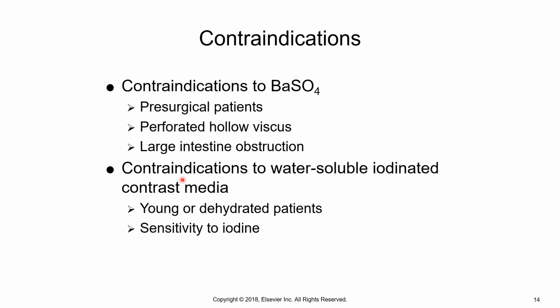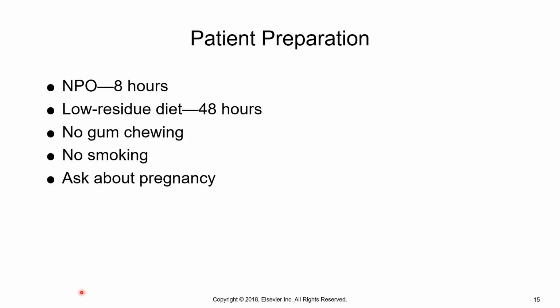Reasons you cannot give water-soluble would be young, dehydrated, or iodine sensitivity. Reasons you cannot give the barium would be pre or post-surgery, 48 hours, a possible perforation, or a possible obstruction, just like we've had when we've talked about those in the past.